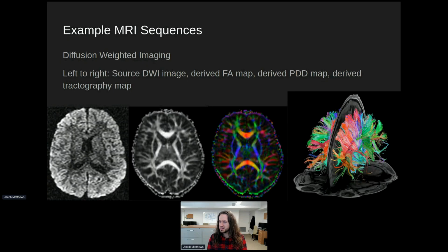And this can be interesting because now that we can follow these water diffusion tracks, they should be highlighting neuronal tracks in the brain. We can make estimates about structural connectivity between regions based on things like this, right? If we're able to find water molecules that preferentially diffuse from one location to another, we have increased confidence that they're structurally connected in some way.